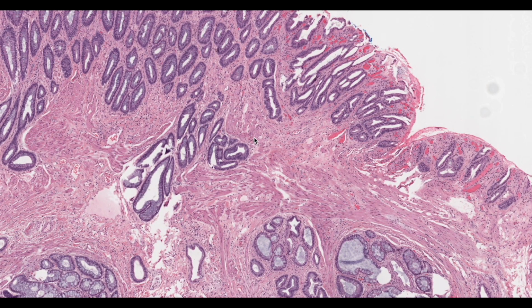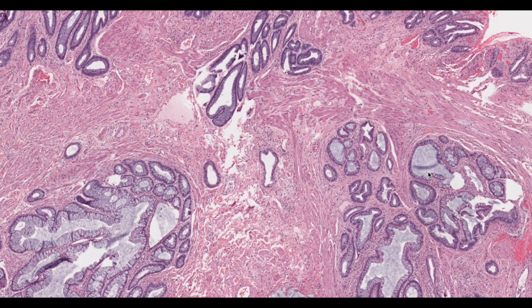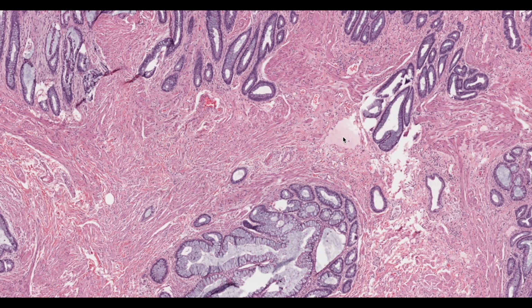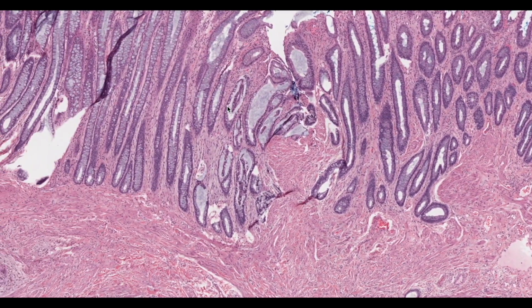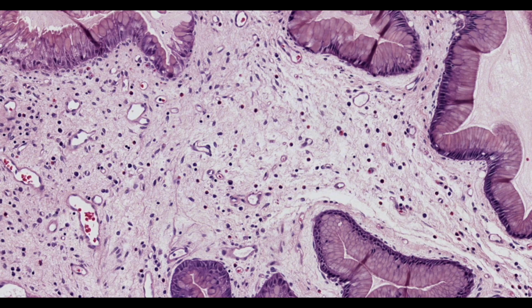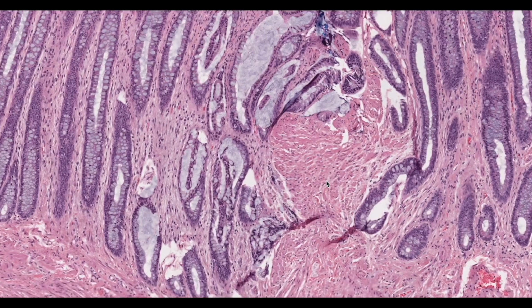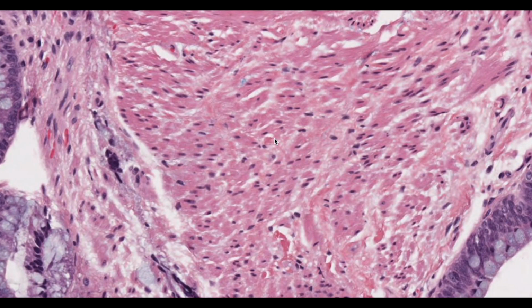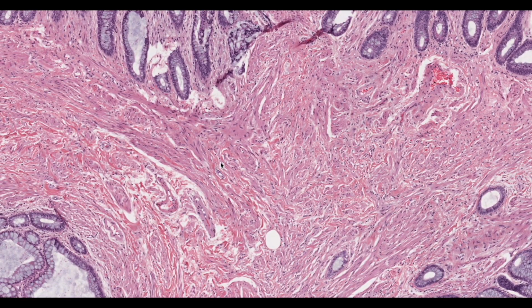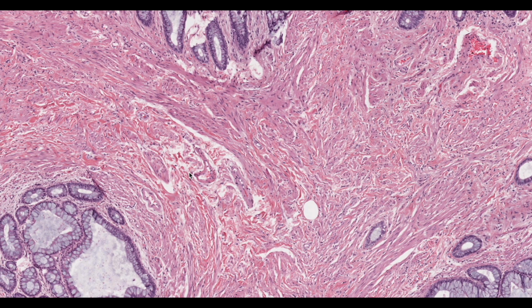There is something called a diamond shaped gland, which is not exactly there, but I would say that this is definitely an irregular gland appearing here, that I can include as a diamond shaped gland, right? Then I do have a good amount of fibromuscular hyperplasia in the lamina propria. I hope you accept that. Compare this with a normal intestinal lamina propria. Definitely pale, definitely pink, and fibromuscular. Look at this, definitely a good amount of fibromuscular hyperplasia. Not just that, when I go to the muscularis mucosae, it's definitely thicker and it's been splayed, with ectatic blood vessels and a little bit of inflammation here and there.